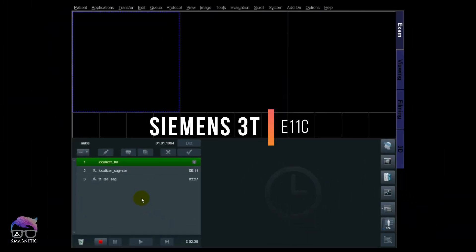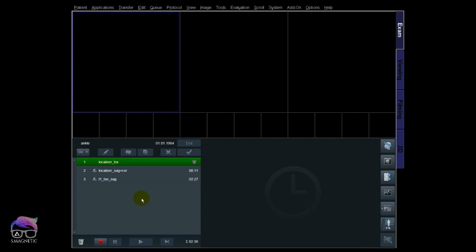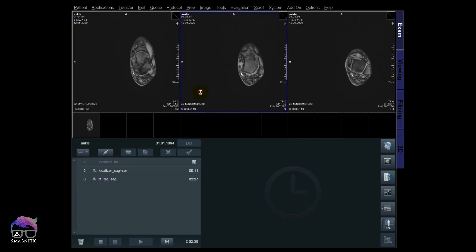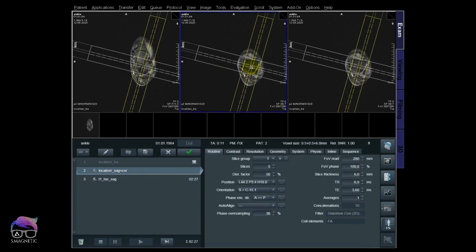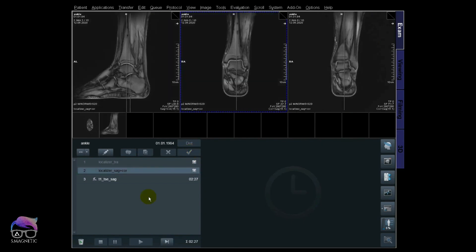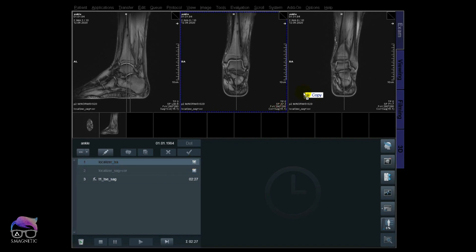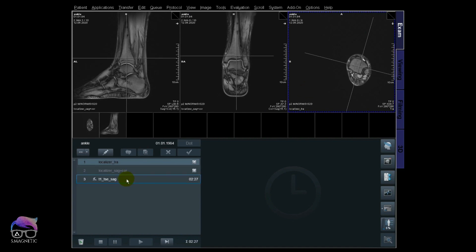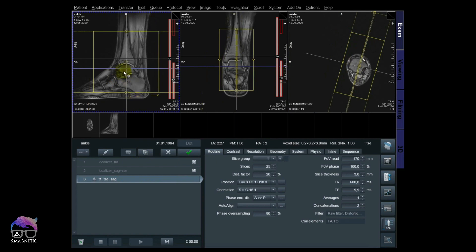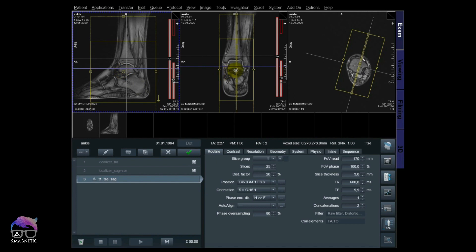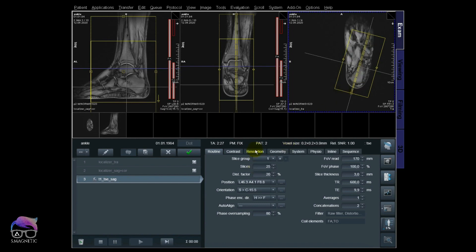We are live at 3T, but what I'm about to show you works on 1.5T as well. This works for 2D sequences, and we're going to watch the difference between different resolutions and compare these images head-to-head at the end. We are scanning the ankle using a 16-channel foot-ankle coil. Let's start with the transversal localizer for the ankle first. I've decided to go for a T1 sagittal to scan at different resolutions and compare at the end of the video.